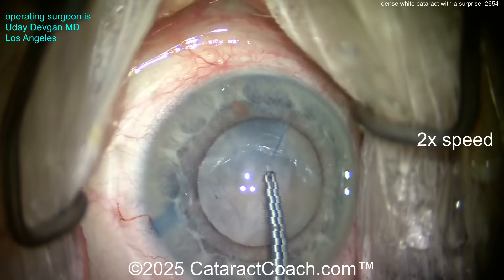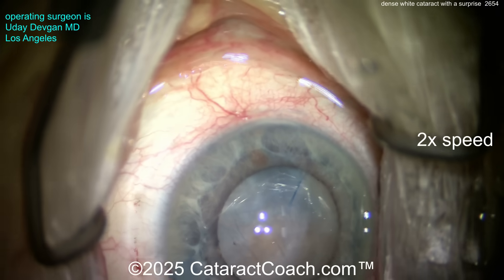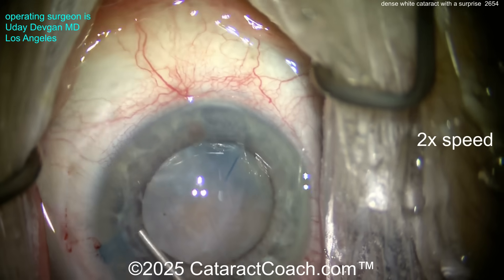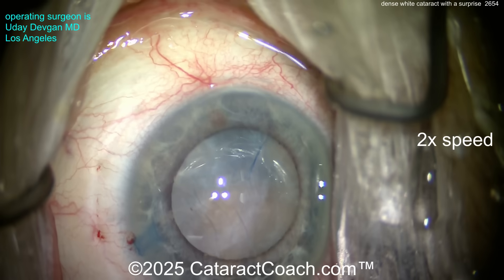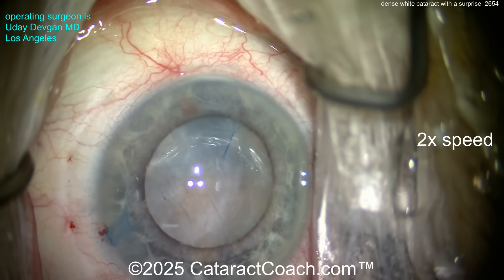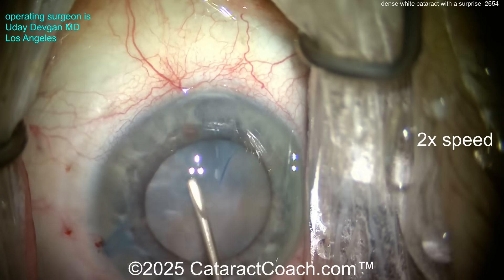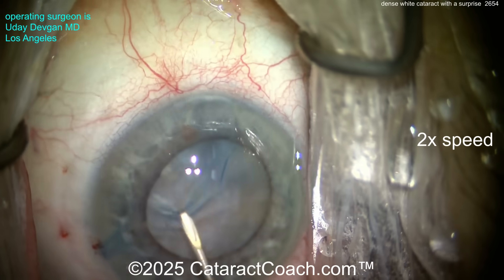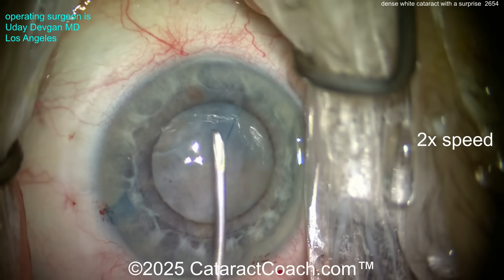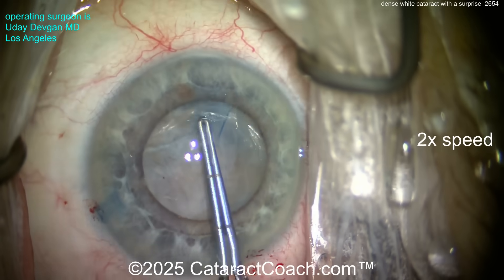Trying to poke with the forceps but it's just too tough — like a thick fibrotic band. Let's get a cystotome, something sharper. A little more viscodilation, a little viscomydriasis — Osher taught us that; Osher is the godfather of cataract surgery videos. Going inside here, let's get that cystotome in. Oh my gosh, look at that dense fibrotic band. Some people say lift up the capsule and go under to remove the fibrotic tissue, but let's see if we can just poke through it.